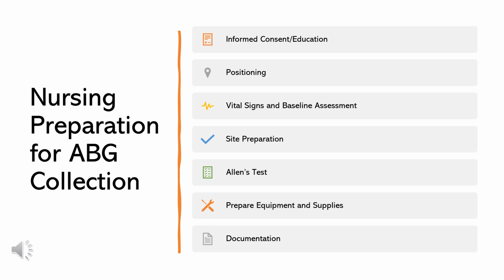prepare the patient. The healthcare provider will obtain consent, but you can facilitate this by educating the patient on the procedure's risks and benefits. Often, the provider isn't as good at explaining things as we are. This not only helps in securing informed consent, but also allays any anxieties the patient may have.